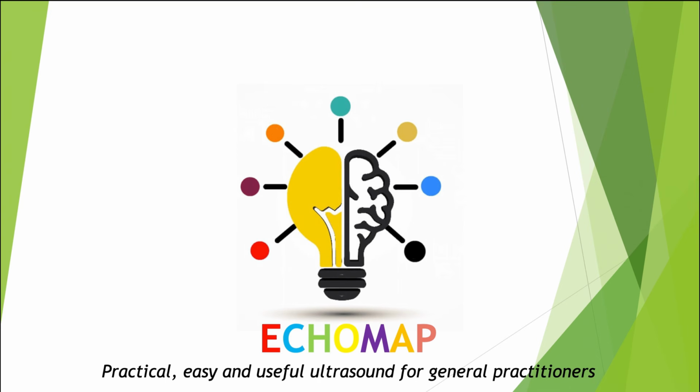So I hope you enjoyed this clinical case, this very practical gynecology case that will really be very helpful to you, especially if you insert IUDs. It's quick, it's informative, there aren't many pitfalls, and there's only one measurement to remember.